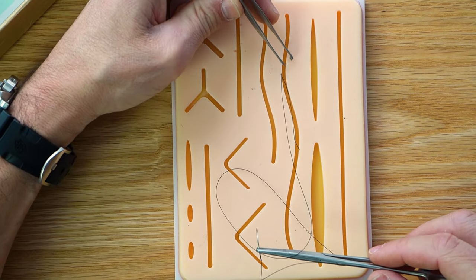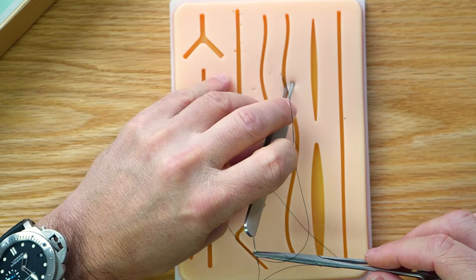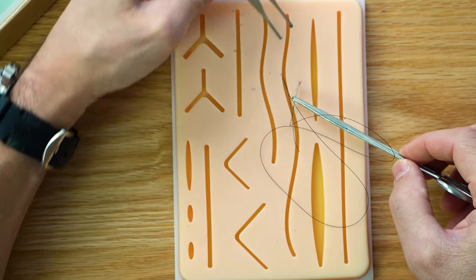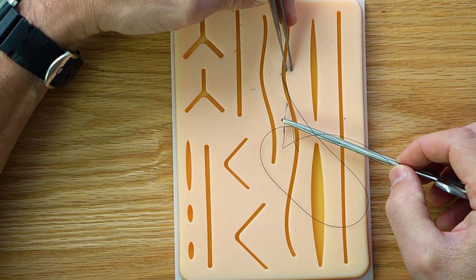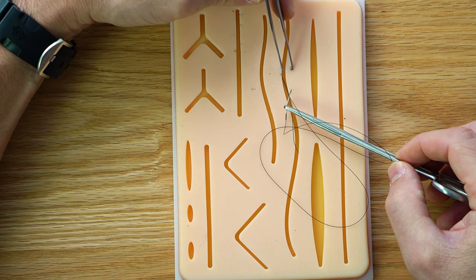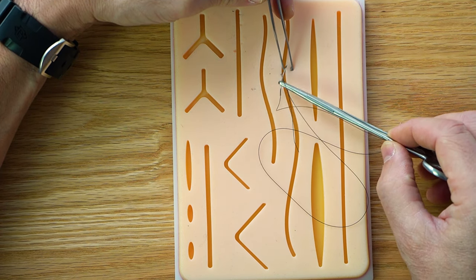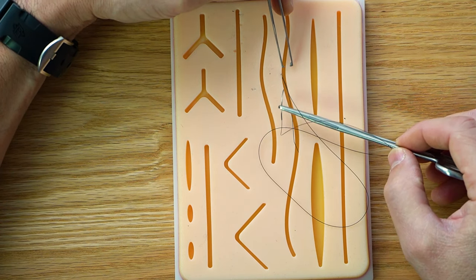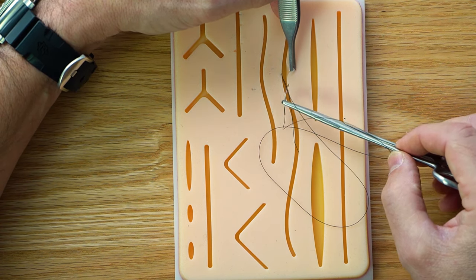My hand is gonna be up top. I don't wanna obscure everything by putting my hand down here. Then I can't really see as well. I'm gonna have my hand up here, okay, and I'm gonna peel this skin back a little bit like this. It works a lot better actually with real skin. I'm gonna peel it back a little bit, so the suture is going in here. I'm going just on the other side of that from myself. I'm gonna grab the skin, I'm gonna peel it back just a tad like this.